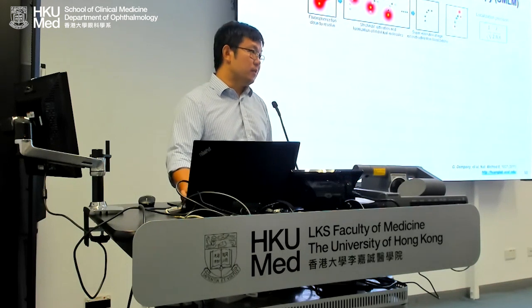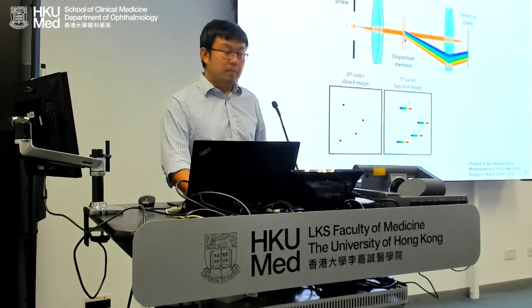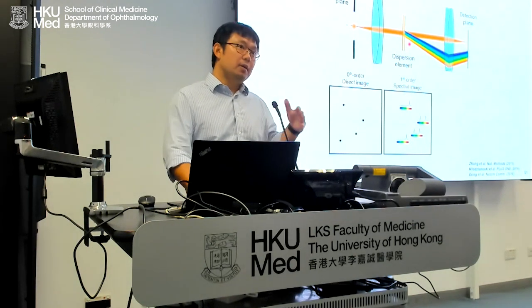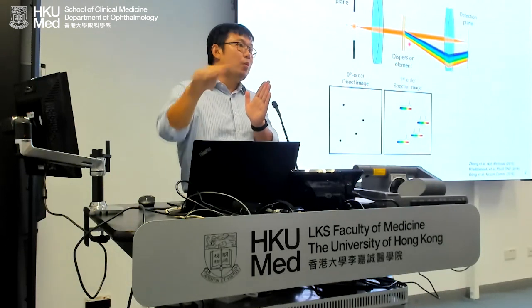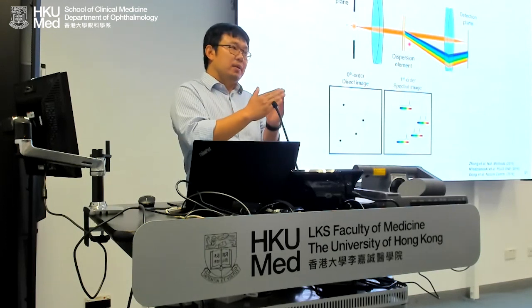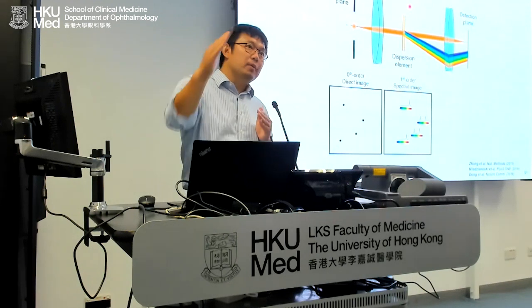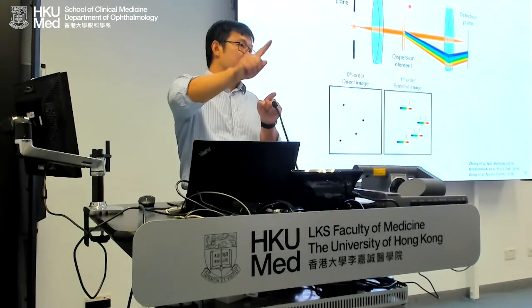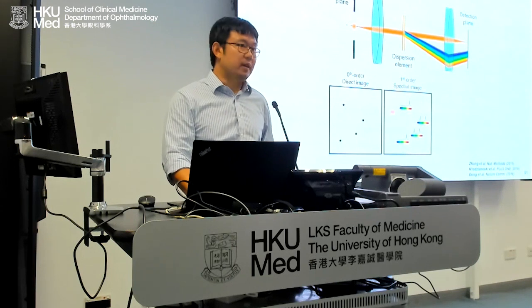That's the Nobel Prize work. The downside is how to tell whether they are the same species or different species. So my lab contributed to the optical design, where we introduce a dispersive component, such as a prism. If you put a prism under sunlight, you will see a rainbow. Why is that the case? Different wavelengths go different paths in the glass because the refractive index is wavelength dependent. Same thing here. If we introduce a dispersive component, we'll have a rainbow. If it's the same color, they just go the same path. So we'll have a localization and we'll have an optical signature associated with it.